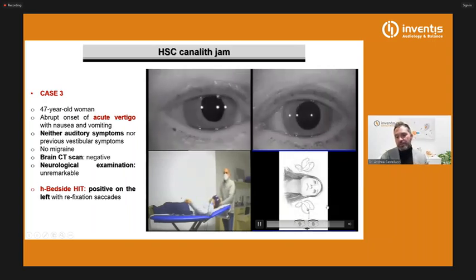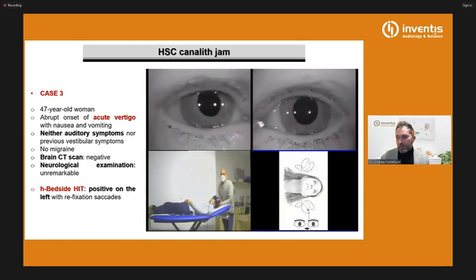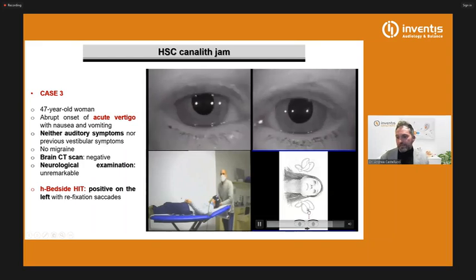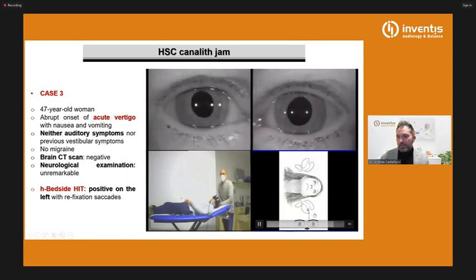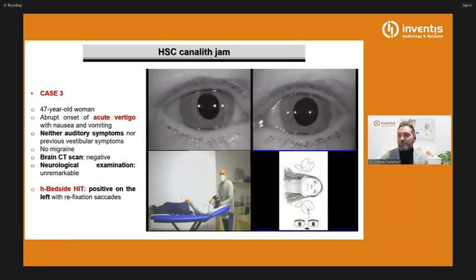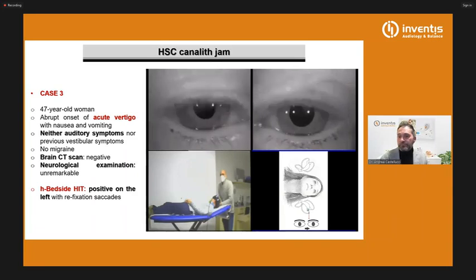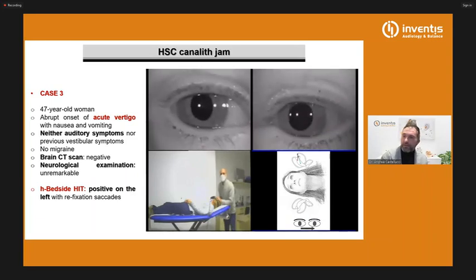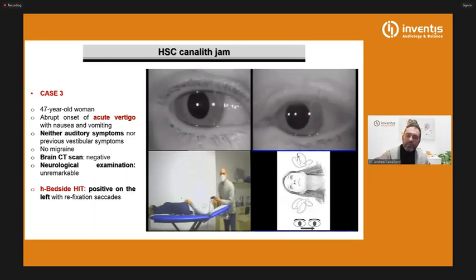And now he brings the patient on the opposite side, and now gravity goes against the positive pressure. So they delete each other. And so you can see now how nystagmus fades, recedes. And he brings the patient back again on the other side, and nystagmus comes back.